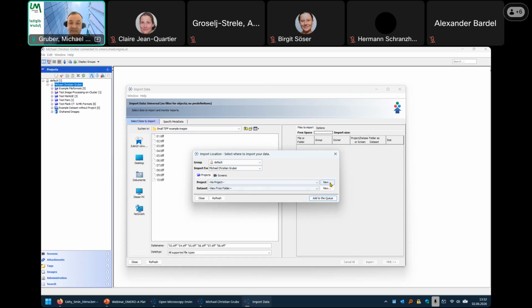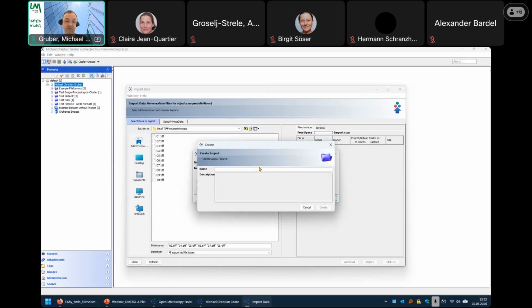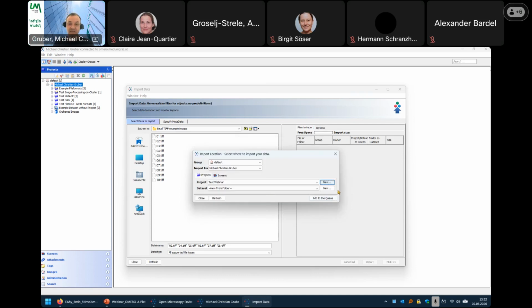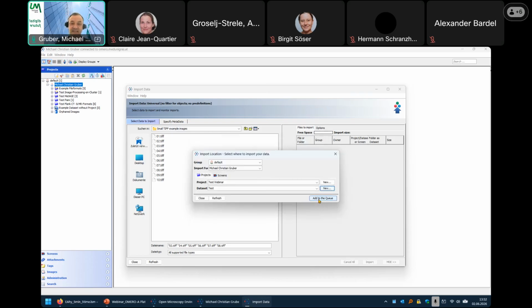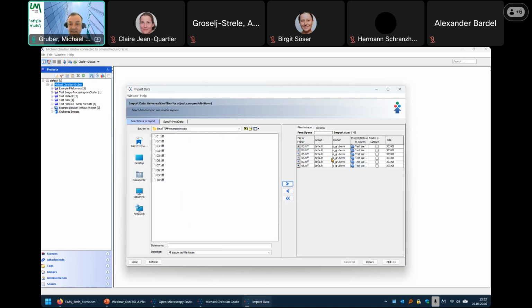So in this case, I'm going to create a new project, as well as a new dataset, which I call just test, create it, and then add the data to the queue.